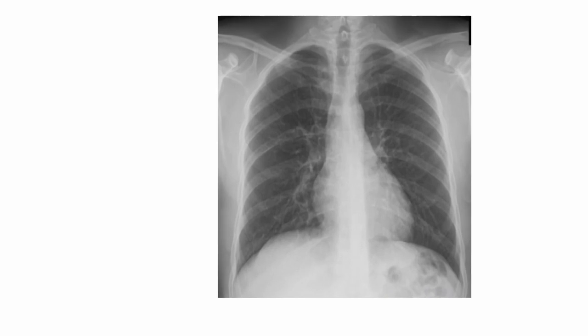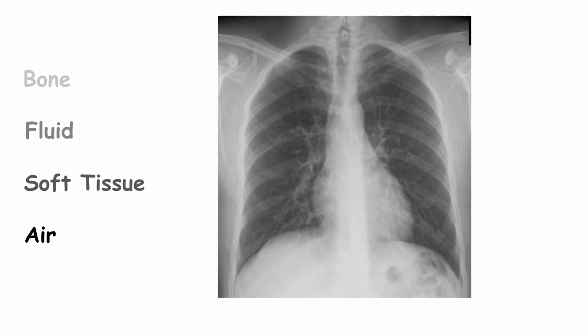Denser tissues, such as bone, appear white as fewer X-rays have passed through. Less dense tissue, such as air in the lungs, appears black as X-rays are more able to pass through. Less dense than bone is fluid, which will appear slightly less white than bone. Less dense than fluid is soft tissue, which therefore appears slightly less white than fluid.